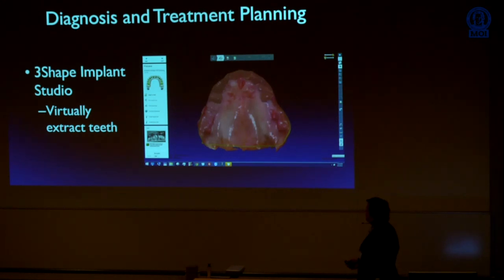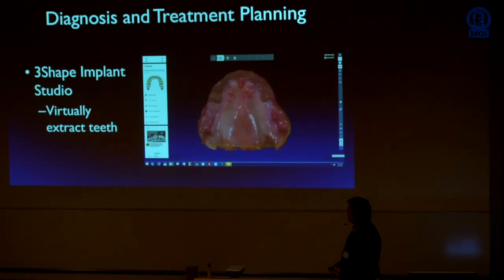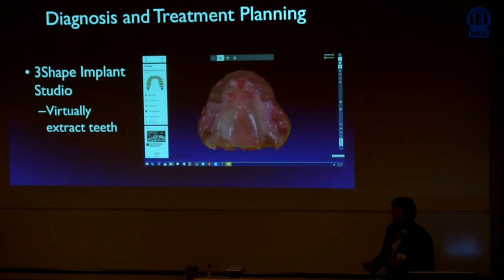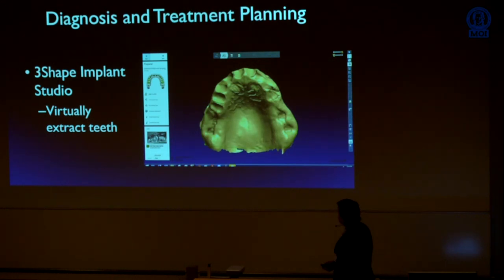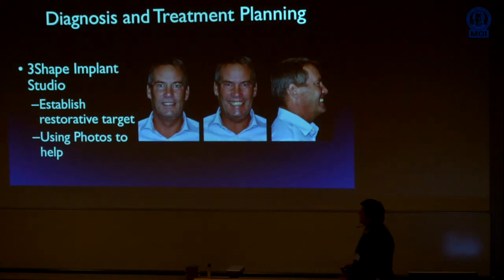It's important to take a digital impression of the upper arch, and I use the Trios in the office. A full arch impression, including the entire palate, being very careful to look for butterflying of the image. You need to get a clean image because the fit of our PMMA provisional and the checking of that is going to rely on a good scan. I like to work in the buff stone version. I feel I can see contour better and I can assess the quality of the scan a little better. We also take a very detailed set of photographs.